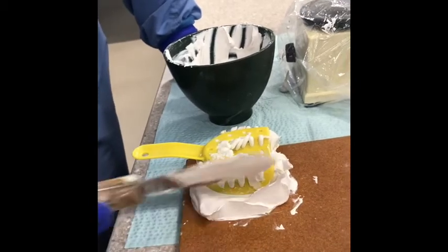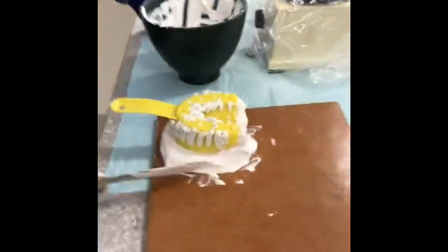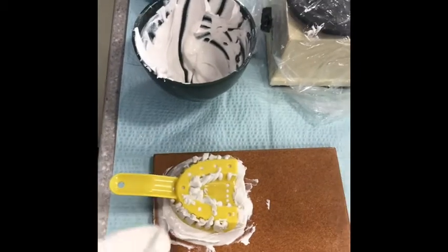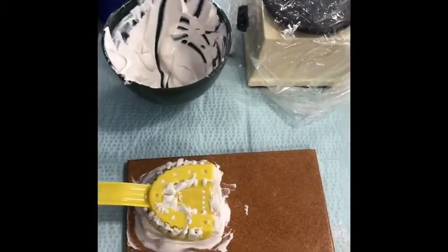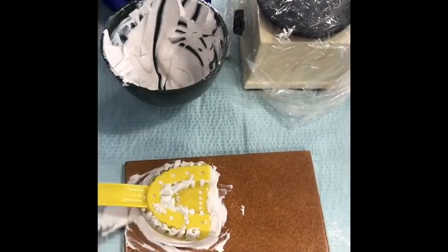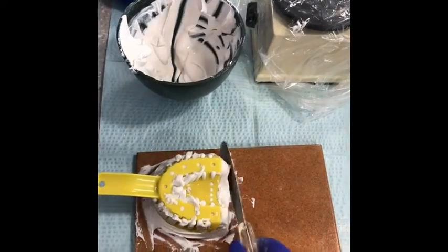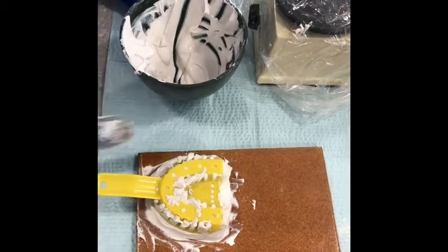Don't pull the spatula too far along the tray, because you don't want it to lock on there. If you have too much and it squishes all the way around, you can just remove that with your spatula. If your material is too runny, wait before doing this method — if you put it on there too soon, it's going to spread out like a pancake and you'll end up with too thin of a base. Let it set a bit before you use this technique.